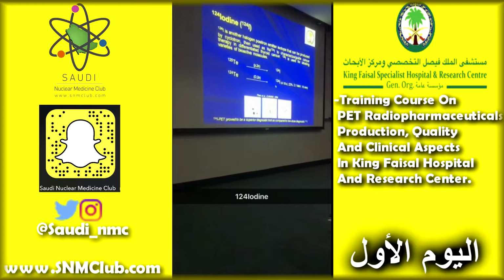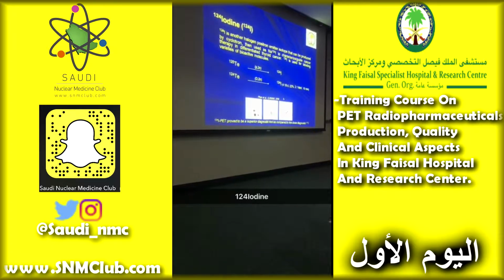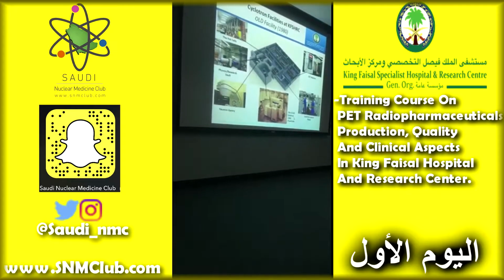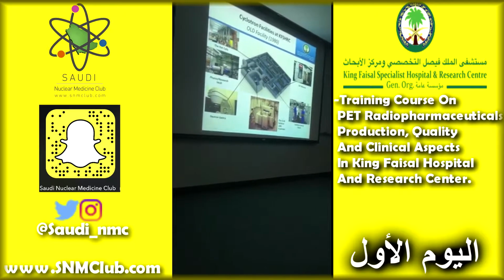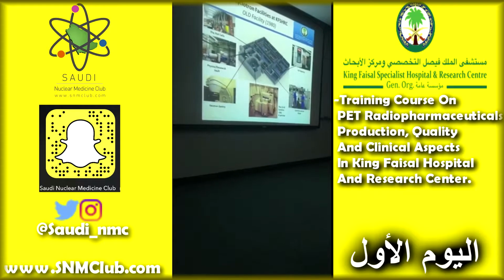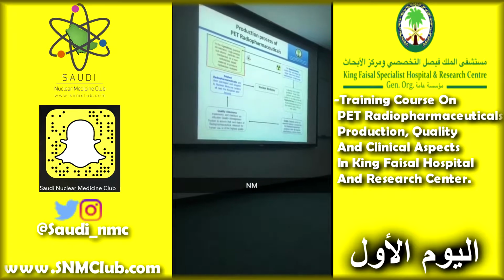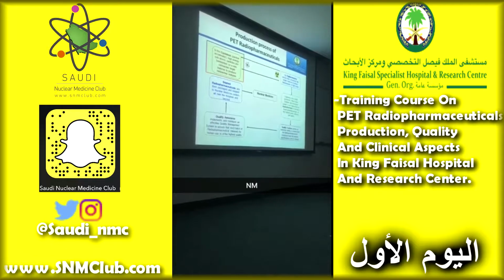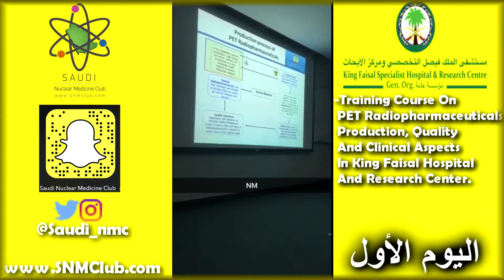It is being used for thyroid imaging and... 1979, something like this, and the production started in 1982. And the nice thing about this... processing, purification, and other stuff before they send it to the radiopharmacy for dispensing.